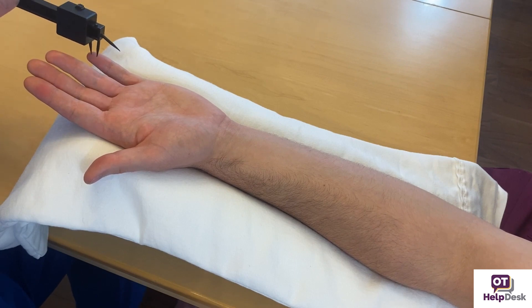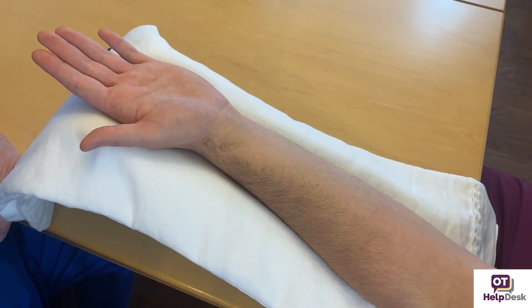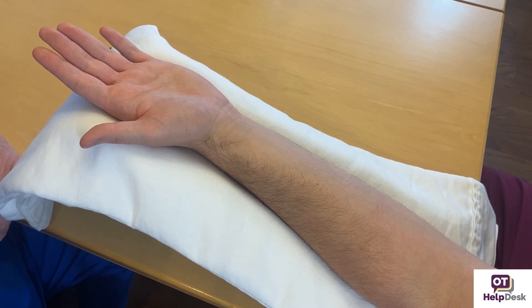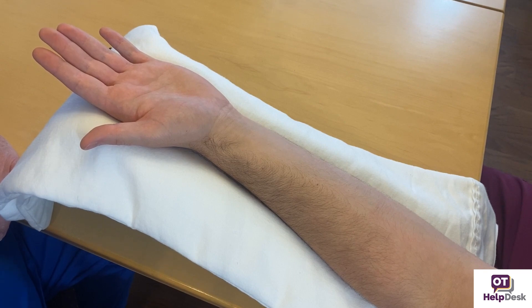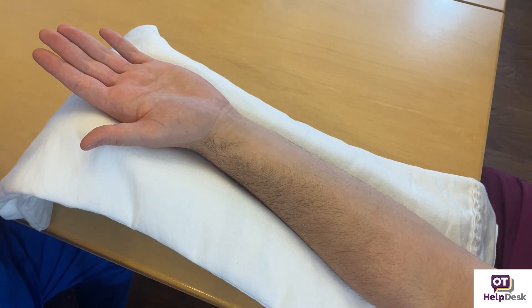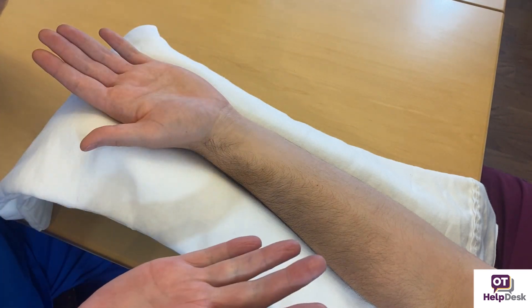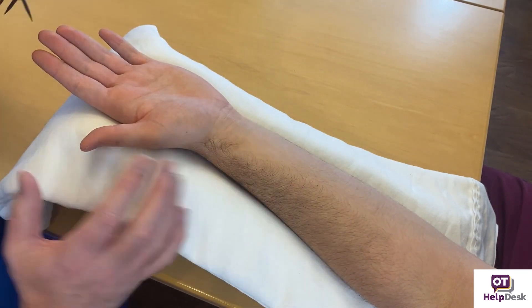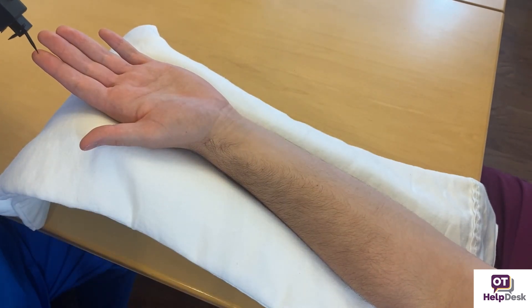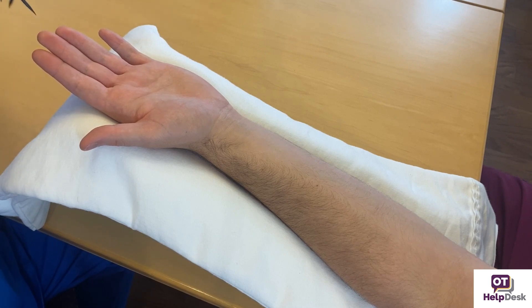Now let me illustrate how to mix the stimuli. When you have two points here and one point here, you mix it up. I hit here — Joseph, what do you feel? One or two points? — One. What do you feel? — Two. One. Two. One.